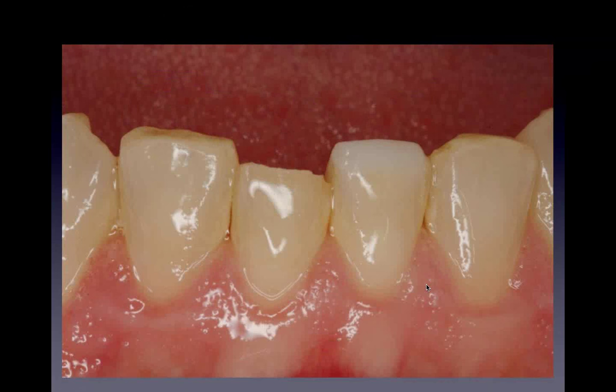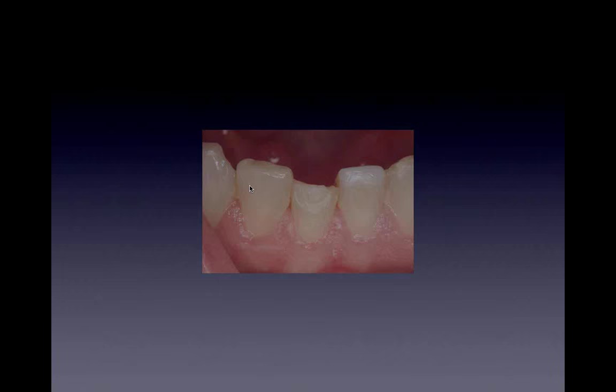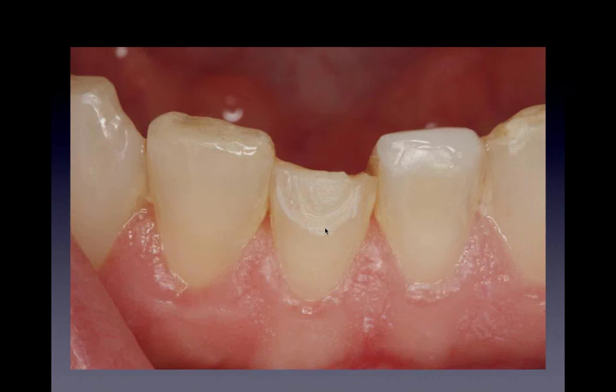See it here, it's just a little crack on it. And again, in my early years, I used to just prepare a little bit of the surface. What we do now is we prepare the facial in a semilunar fashion, and the lingual. So you'll see the preparation on the lingual. This is the facial. So I want to get a nice blend of the composite. I don't want to just end it here in terms of strength, in terms of wear, in terms of polishability. I just like to cover more of the tooth.